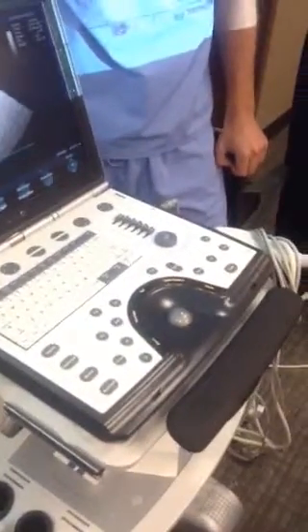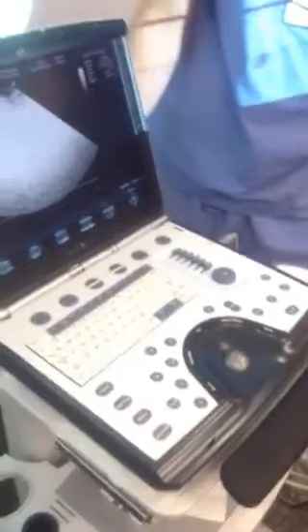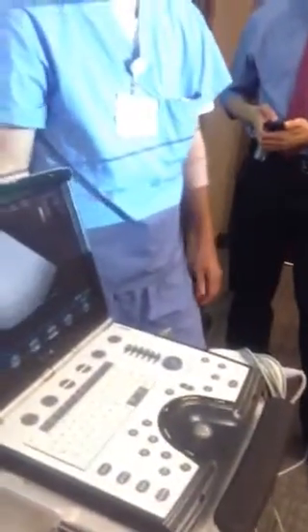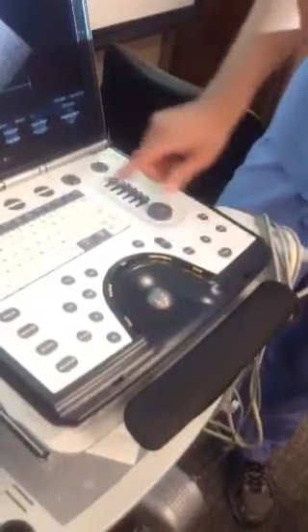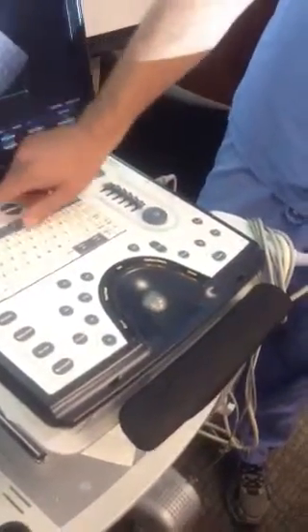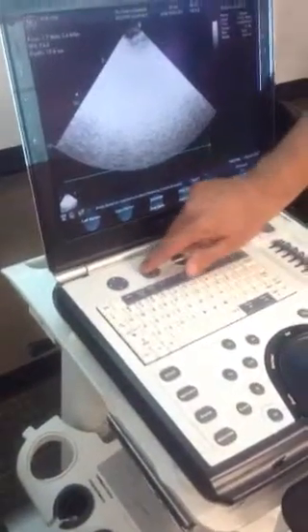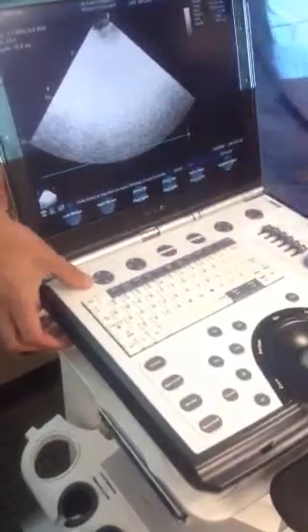If the EKG is not working well, it won't record anything. It was a problem, it wasn't picking. Yeah, I mean, it will record. It just won't record a whole beat. It can get a half beat. It can get 2 beats. And that's one of the challenges. What's nice about this machine is as you record, you can move your left and right marker forward and backwards if you want to make sure you get a whole beat in the cycle. And that's over here with these two toggle buttons.